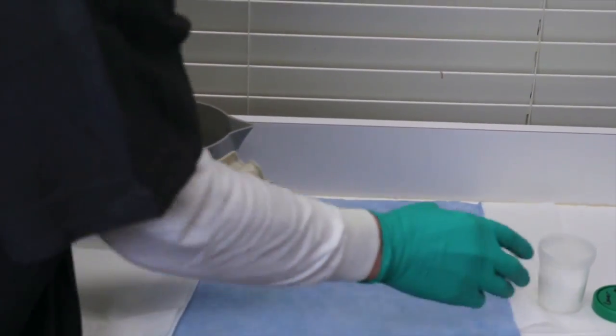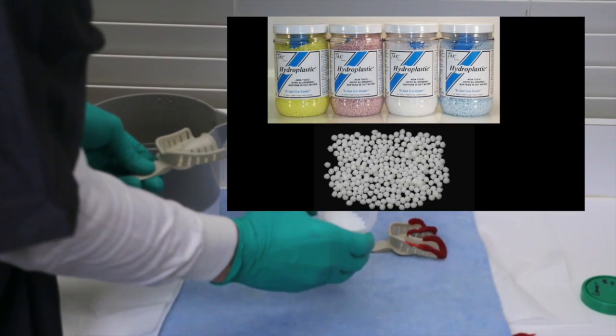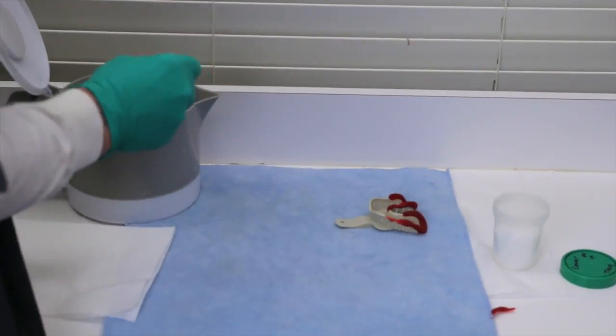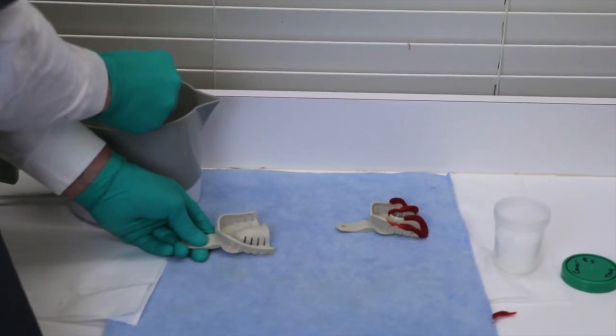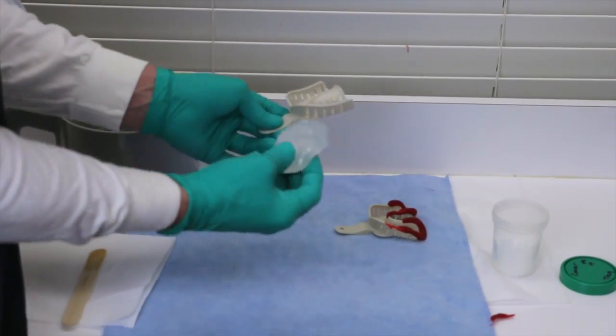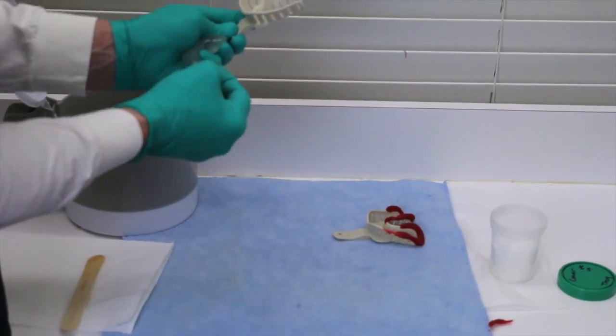Now, for the use of the rigid material, which is going to be much more accurate, we're going to demonstrate a material called tack. Tack, as you can see here, is a thermoplastic that comes in these little white beads. When you put it into heat, and this is nothing more than a coffee pot here, the material comes out, turns clear, and becomes very pliable. It's a very sticky material.